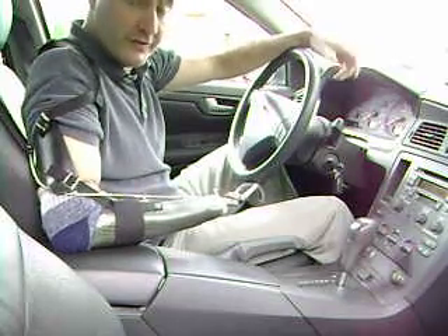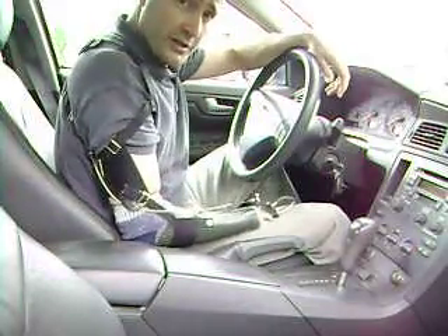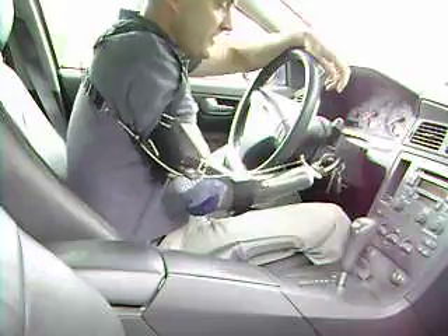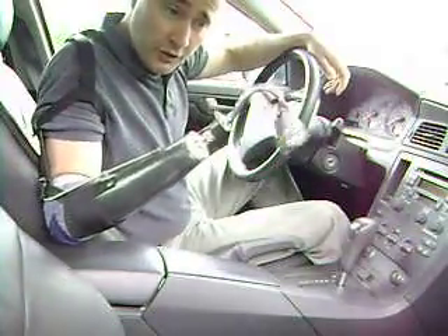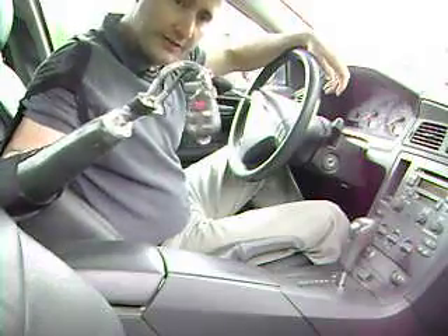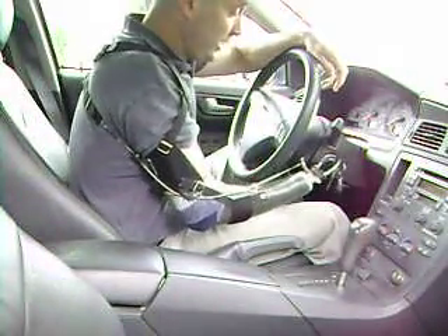Turning a car key with a prosthetic hook takes a little practice, but you can do it. It's all about positioning. It helps if you start by having somebody put the key in, then take it out, and take a good look at where that key is in position on the hook, and put it back in that same spot — then you're lined up to insert it when you go in.